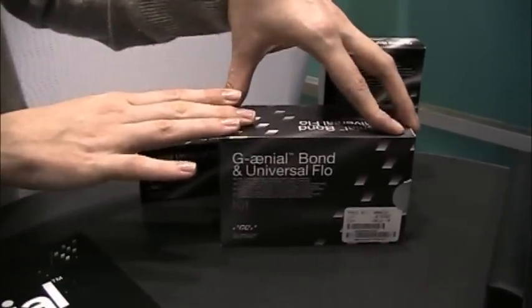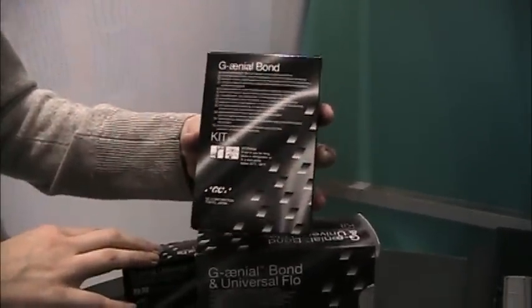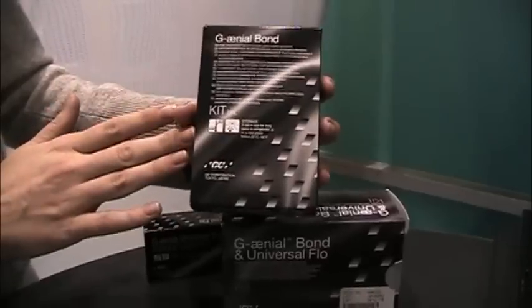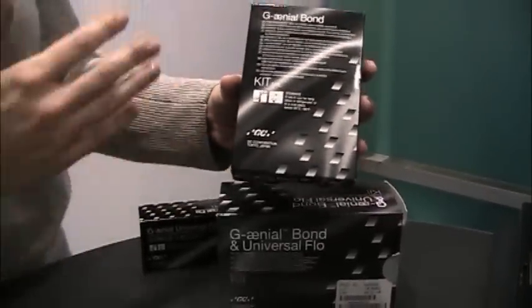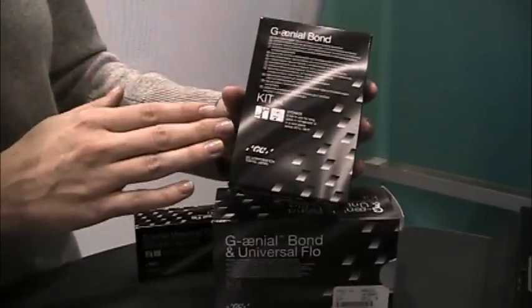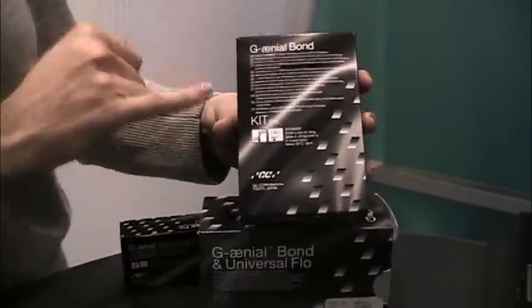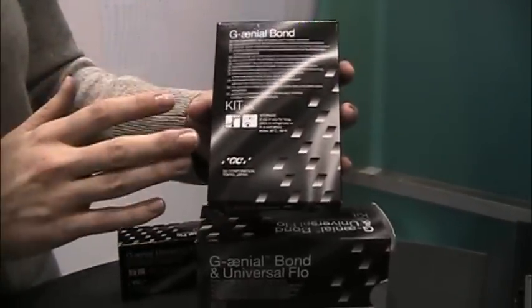This kit contains our new 7th generation, one-step, self-etched bonding agent. For those of you that like the all-in-one bottle, this is our new product — a great product for you. Now if you're a dentist that still prefers to etch, this was actually designed with you in mind also. You can etch with this product, and it's designed to not only be self-etched, but also work for those who want to etch and rinse. A great bonding agent.